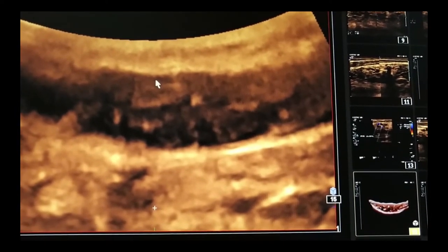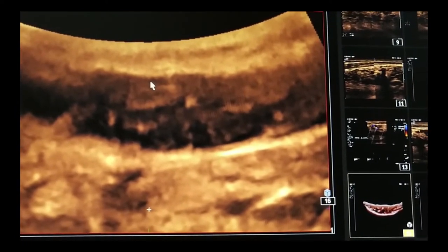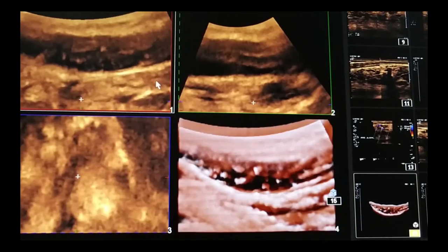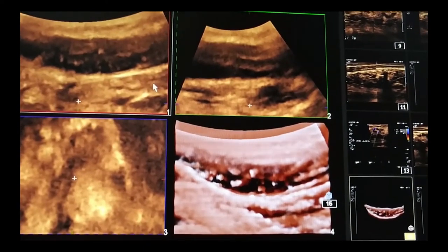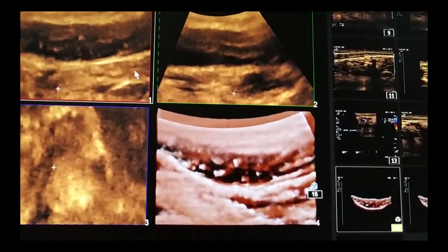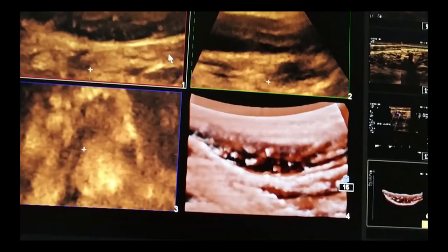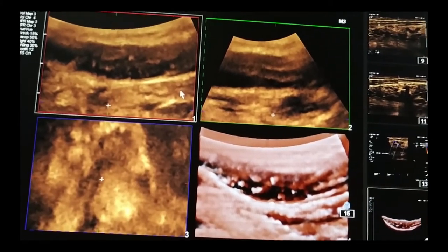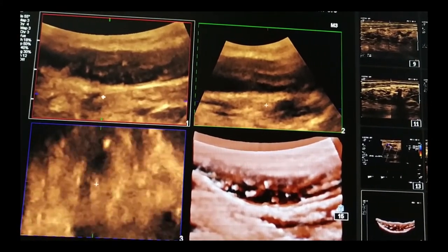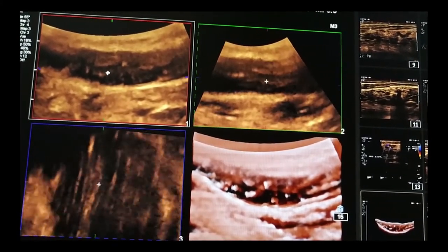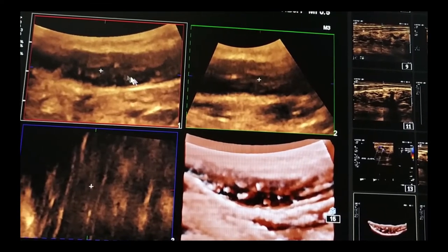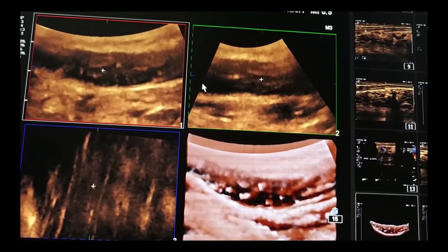The volume acquisition is done by pressing the 3D button over the lesion. I am targeting the upper and left picture, taking the plus point to the lesion by the cursor. You can see that the other axes are getting changed.